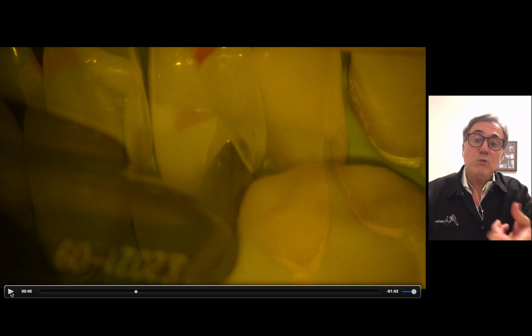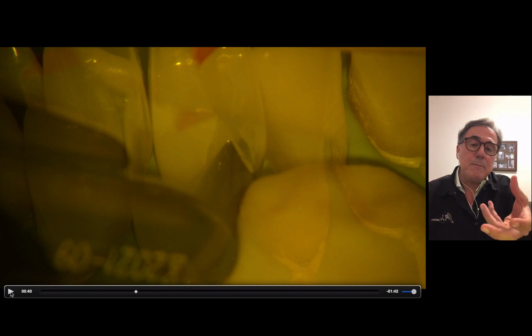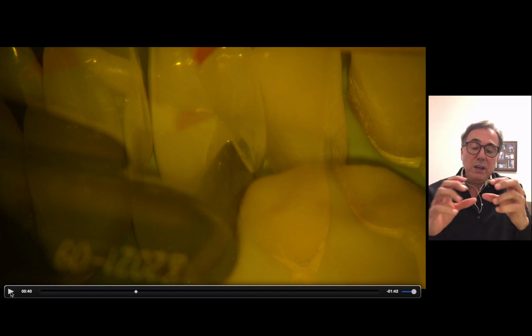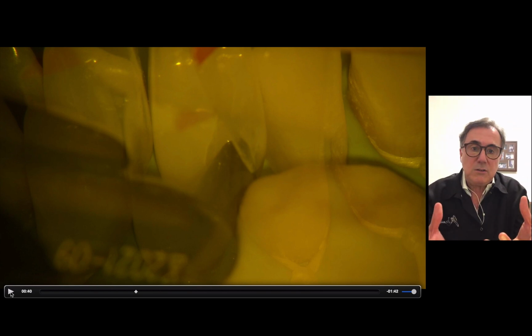Then we're going to do something that Bioclear suggests, which is called injection molding. It's a way of placing the composite inside the matrix so that you're going to have a very hard, very bubble-free body of composite, okay?